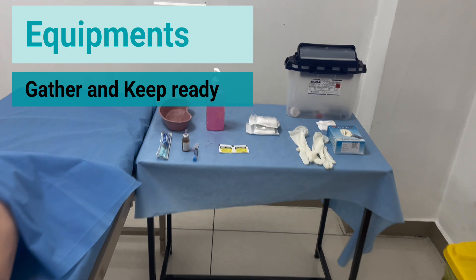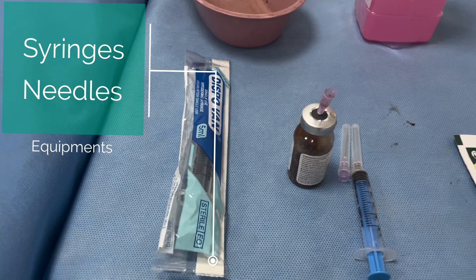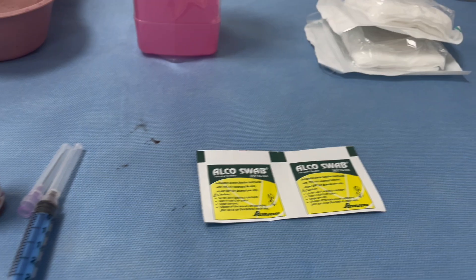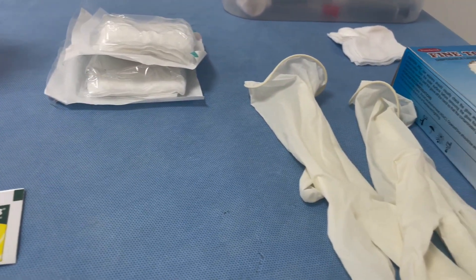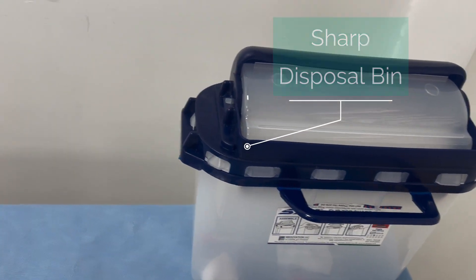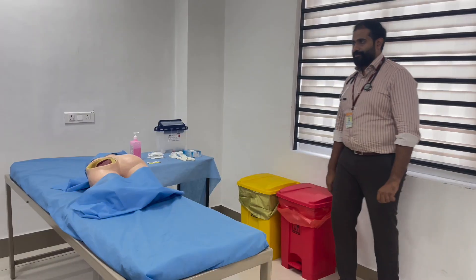The first step is to gather all the necessary equipment. The equipment needed are syringes and needles, medication vials, alcohol swab, gloves, a sharps container or a disposal bin, hand sanitizer, and necessary gauzes.